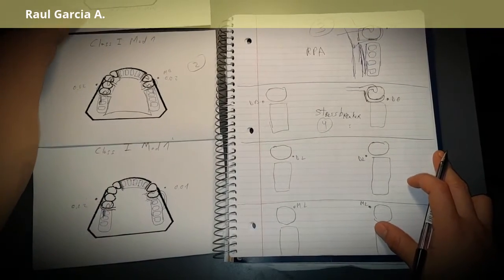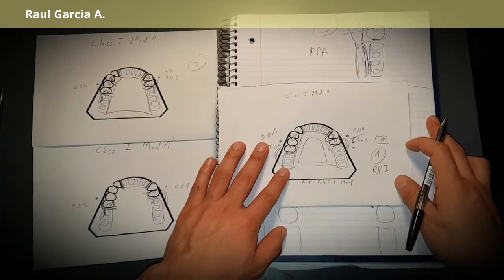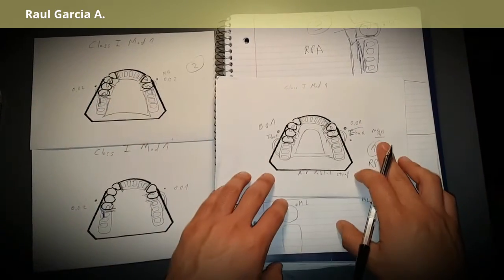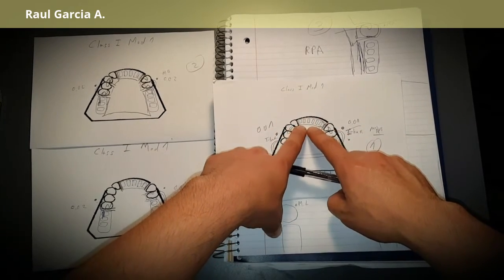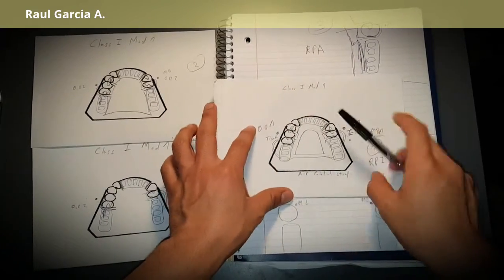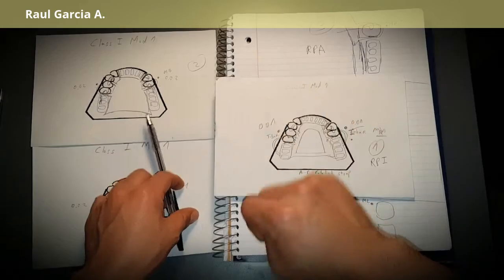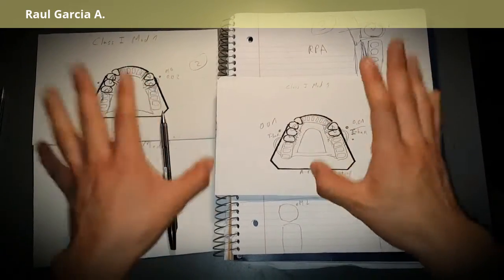Now we're going to see a Class I design. I'll tell you the steps to follow. We have a bilateral free-end saddle and another edentulous area — a Class I modification one in this case. When you have a free-end saddle, you have four options for clasps.